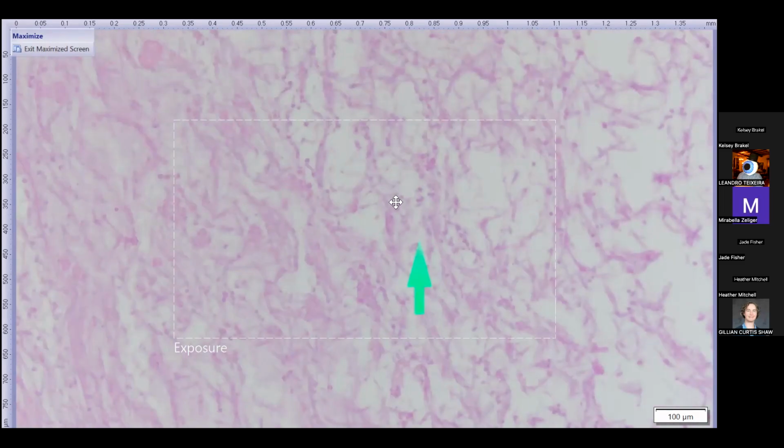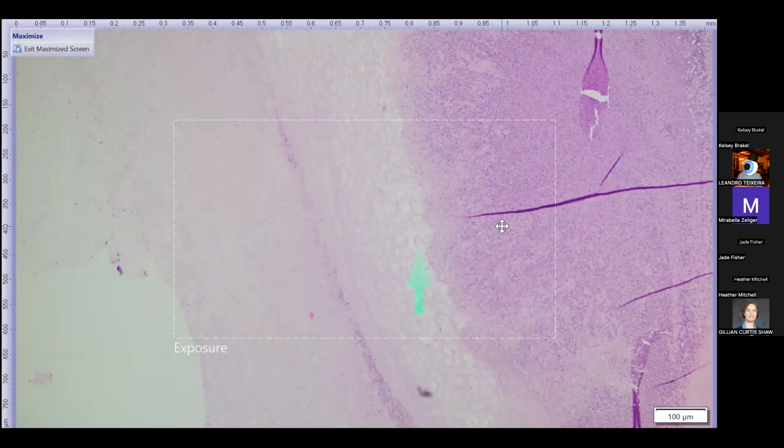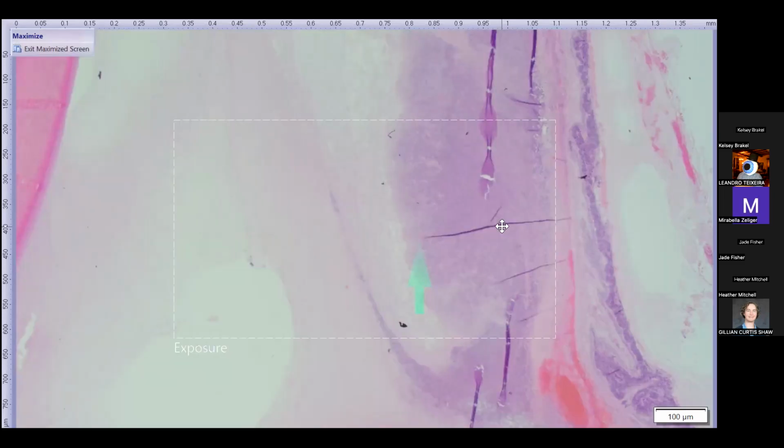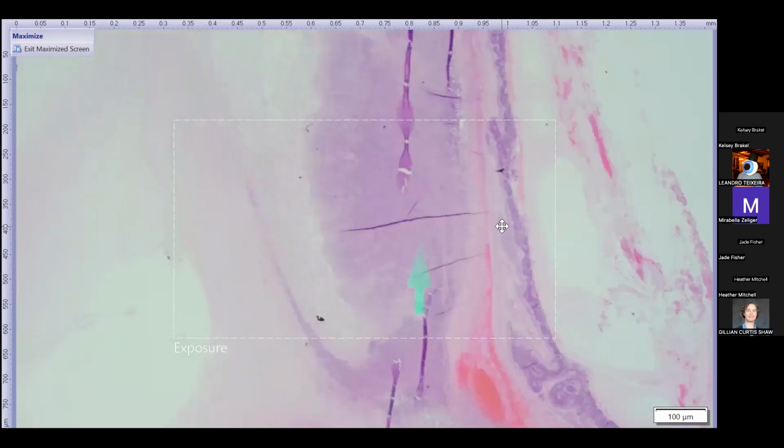In fact, the finer stuff, like right in here, is fibrin, but then you can actually see that these little end-on purple guys and some of the more linear purple guys like this right here are fungal hyphae. So we can actually see them on the H&E, but I did get a PAS, so I'll show you that in a moment. But let's continue with looking at what else we have here. So there's like a bajillion fungal hyphae in this eye.